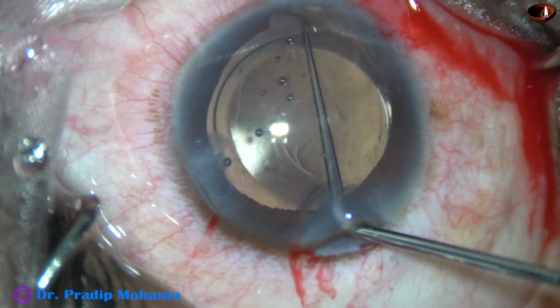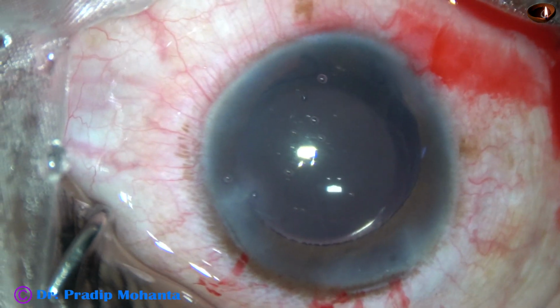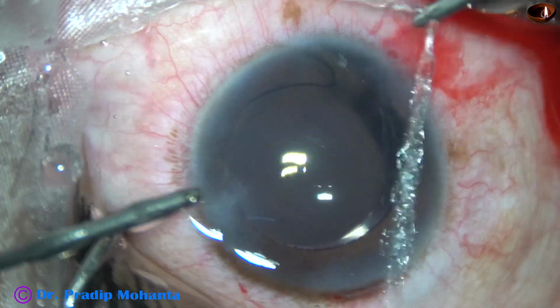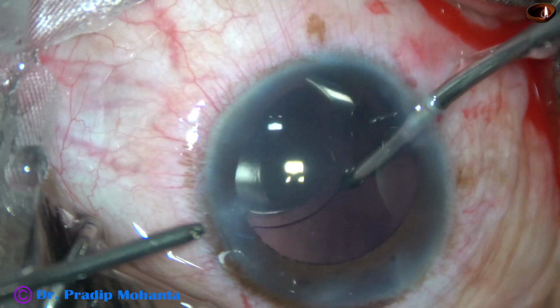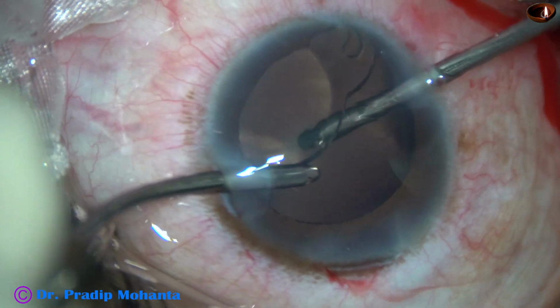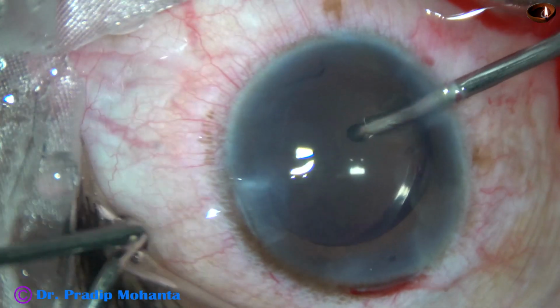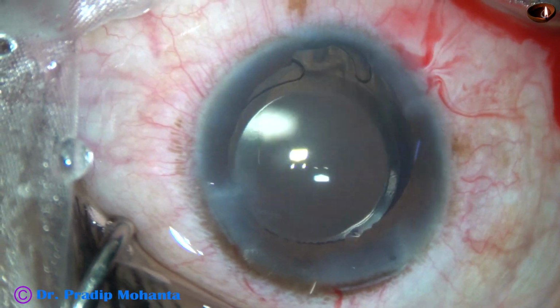And now the visco is cleaned first with Simcoe. That part has been edited out, and then with this bimanual irrigation aspiration. Visco from the bag is being removed in this way. The irrigation goes behind the IOL and the aspiration remains over the IOL or at the edge of the lens, and the visco is removed from behind the intraocular lens.